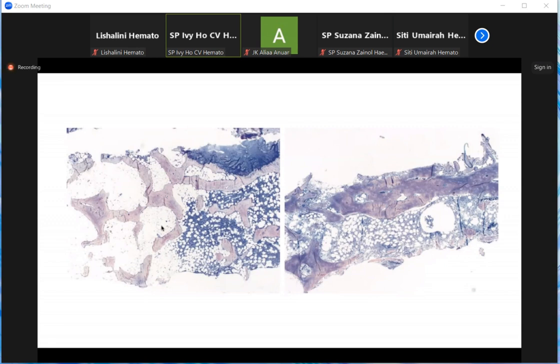So it's very important for us to go further down. And if the core biopsy length is not sufficient, you have to mention it in your report and alert the clinician, saying your core is not long enough, not deep enough, so I say it's slightly hypocellular here, but it might not represent the whole picture. So we have to warn them.